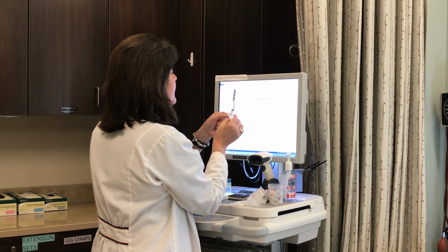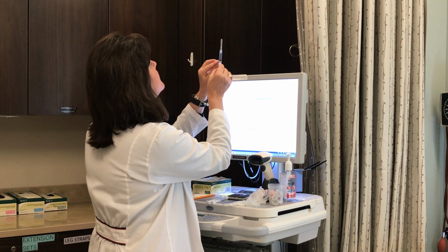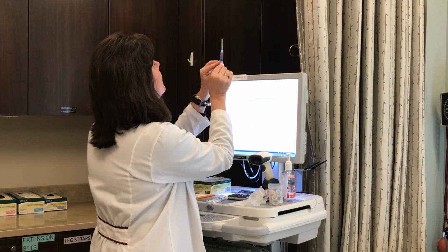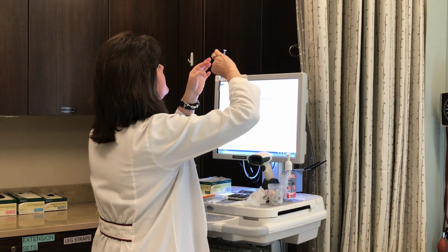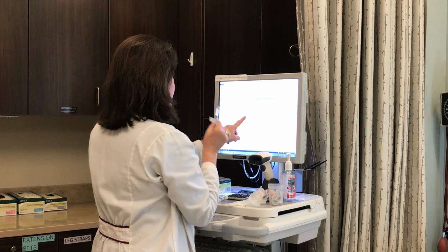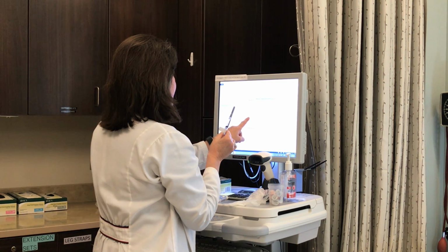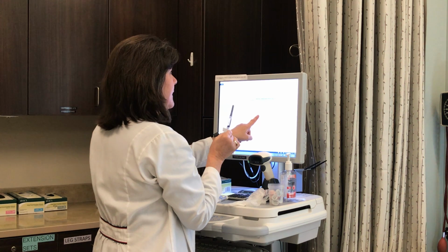On my label, I have 200 milligrams equals 1.6 mLs, and I have 1.6 mLs without any air bubbles. The route is IV push. I'm going to administer this through her IV. Frequency is daily, due at 0900, and it is 0900.